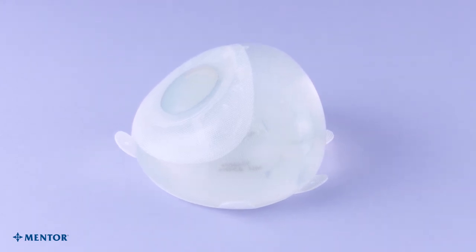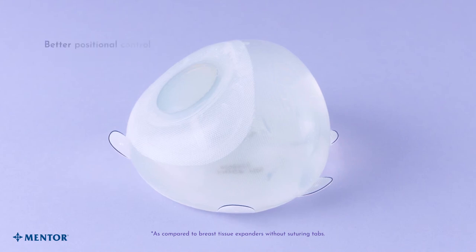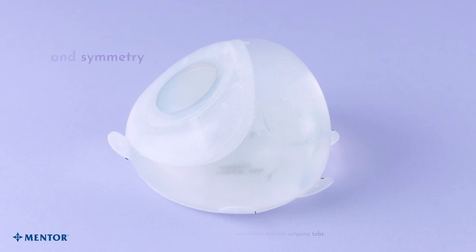Accidental deflations can result in additional surgical procedures. Suture tabs offer stability to the placement of the CPX4 Breast Tissue Expander inside the newly formed pocket, allowing for better positional control and symmetry in bilateral breast reconstruction.